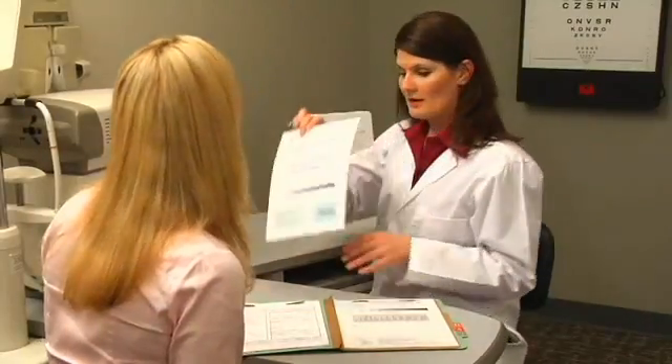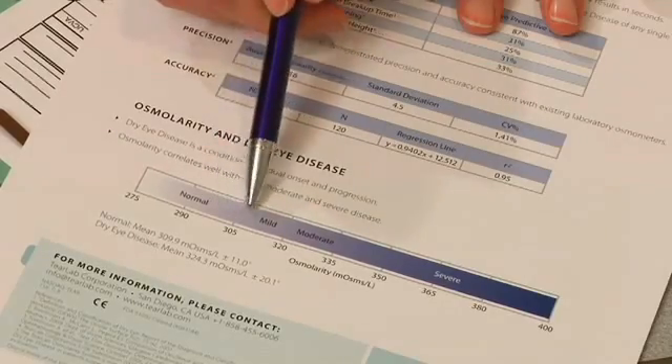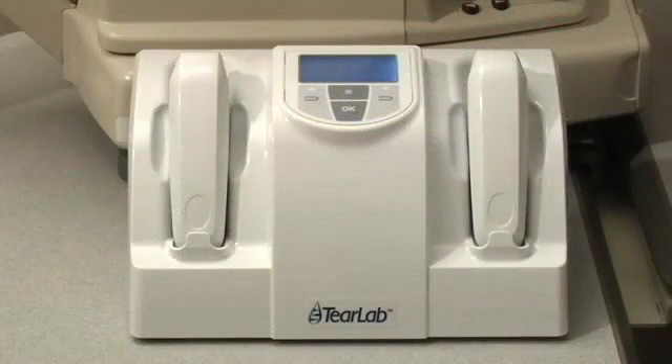Now that you have recorded the results in the patient's chart, you are ready to discuss the results with your patient. You have seen and experienced how easy it is to use TearLab. If you have additional questions, please call customer service.